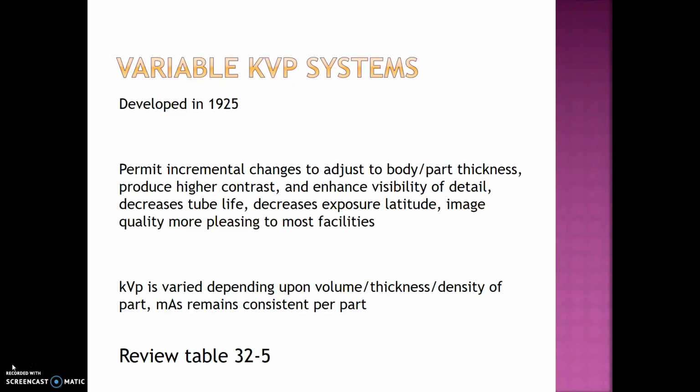Variable KVP systems were developed in 1925. These systems permit incremental changes to adjust body part thickness and produce higher contrast and enhance visibility of detail, decrease tube life, decrease exposure latitude, and image quality is more pleasing to most facilities.